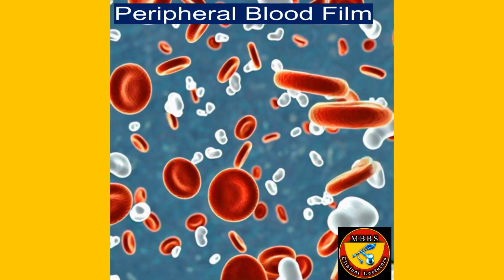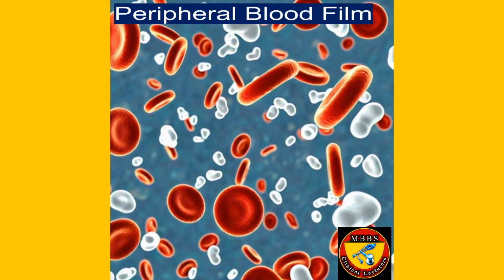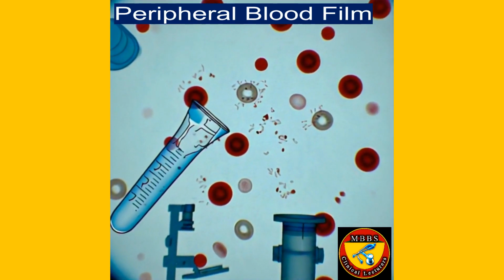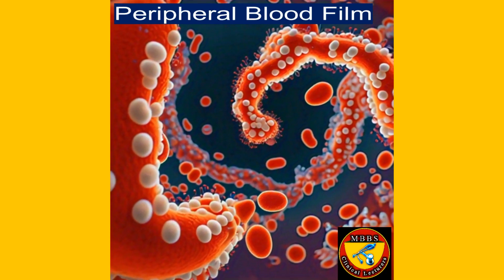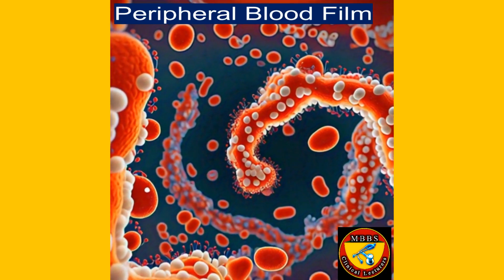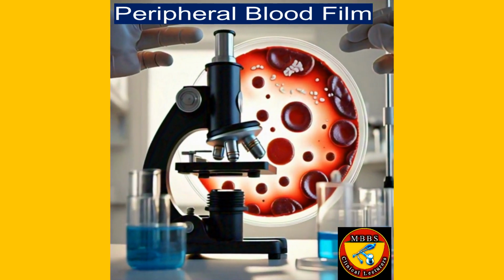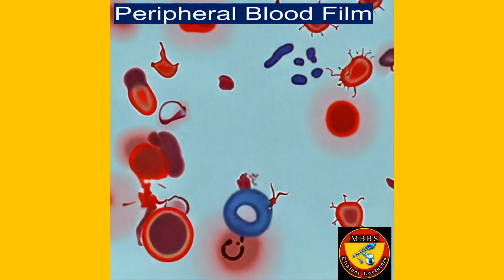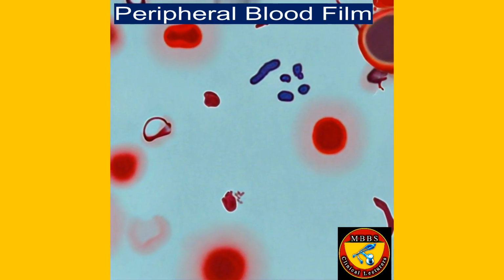Clinical significance: 1. Anemia diagnosis, assess RBC morphology to diagnose types of anemia. 2. Infection detection, identify WBC abnormalities or parasites, e.g., malaria. 3. Hematological disorders, diagnose conditions like leukemia or lymphoma.